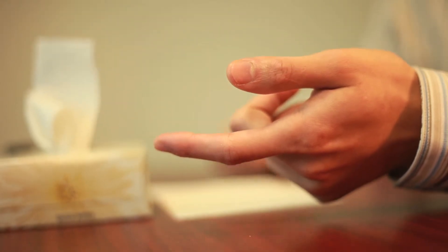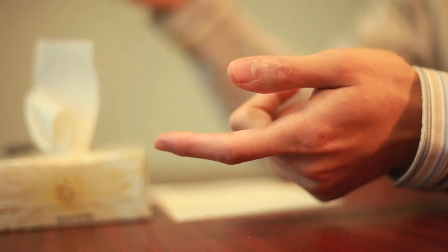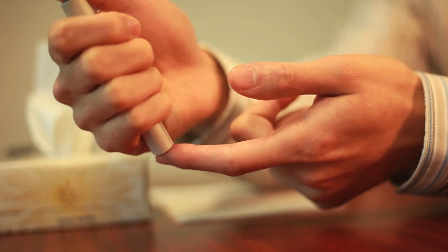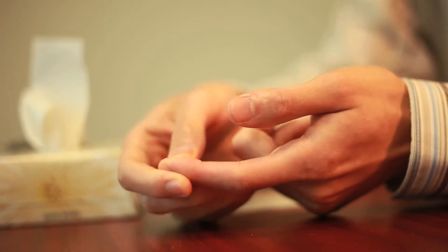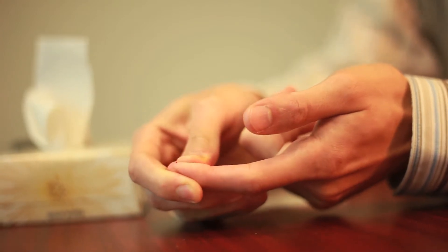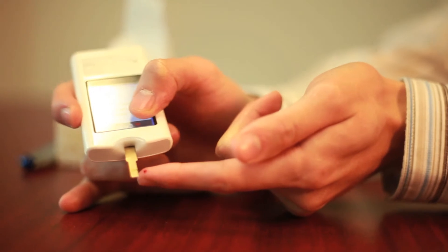This is the stage where most people get anxious because they're getting a little finger prick. However, these lancets are adjustable so you can minimize the pain, still get a good blood sample and a good blood test.